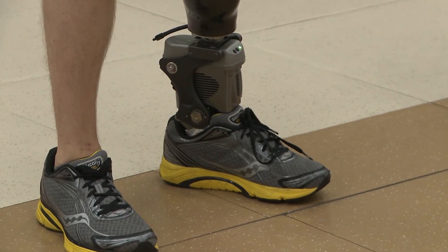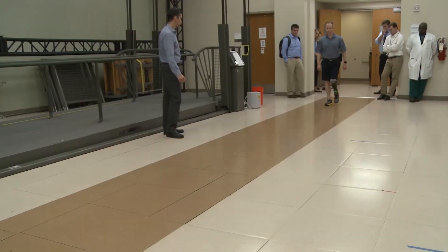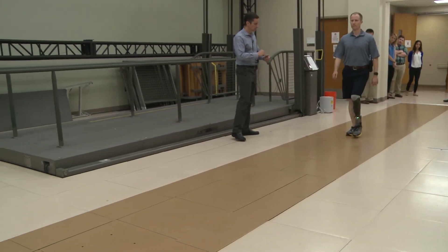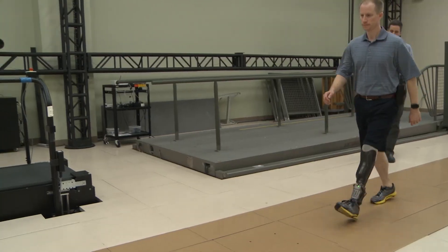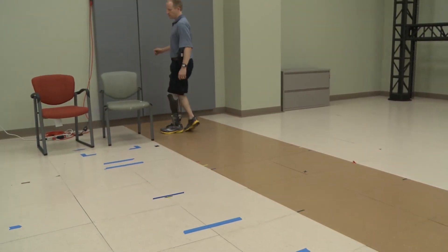We were tasked with taking our powered ankle prosthesis technology, making it ruggedized and waterproof, building a powered ankle that is capable of supporting running gait as well as walking gait and navigating those transitions.